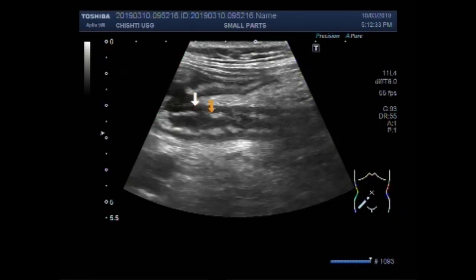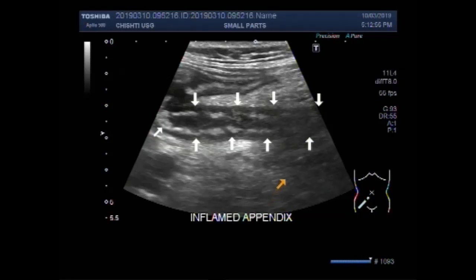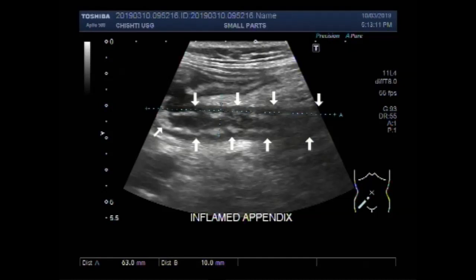This is the inflamed appendix. This is quite a large appendix — you can see it measures about 6.3 cm x 1.0 cm.